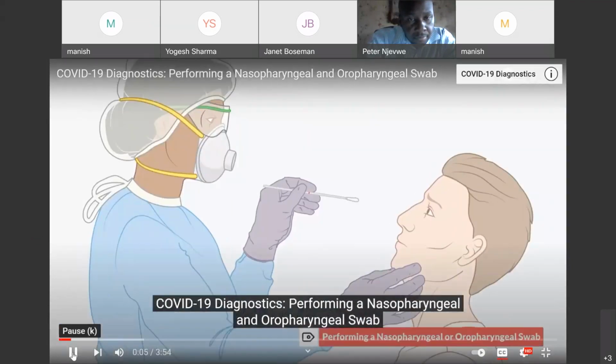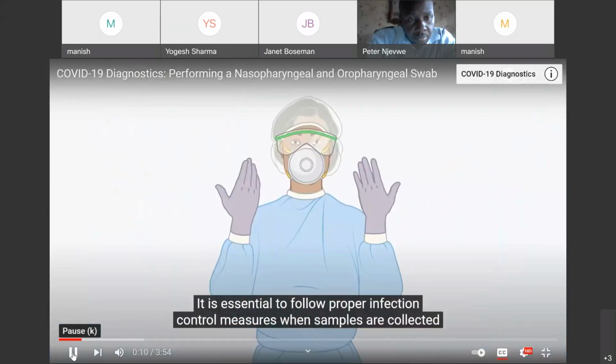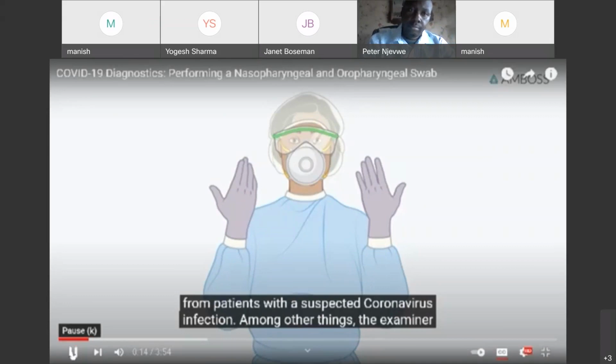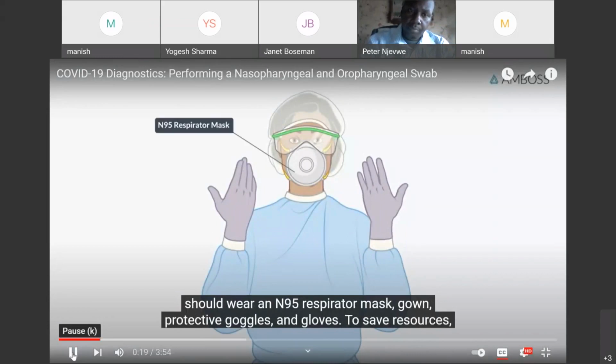For performing a nasal swab diagnostic, first of all, we have to wear all the control measures as shown in the photographs: the hairnet, goggles, N95 mask, gloves, and the gown. Respiratory mask, gown, goggles.